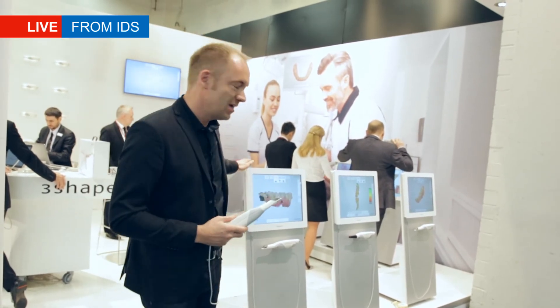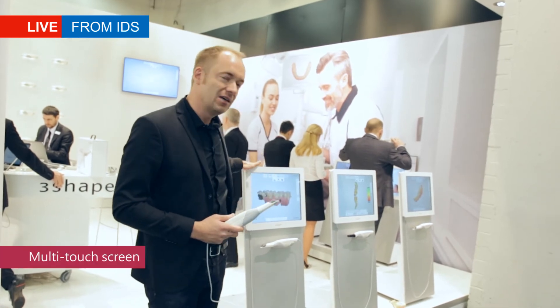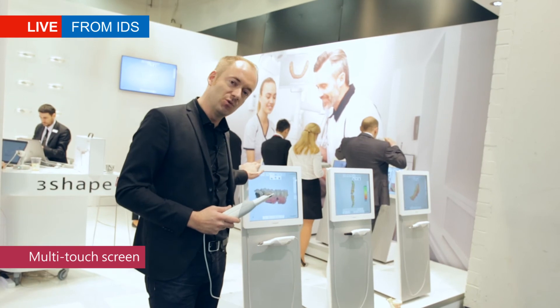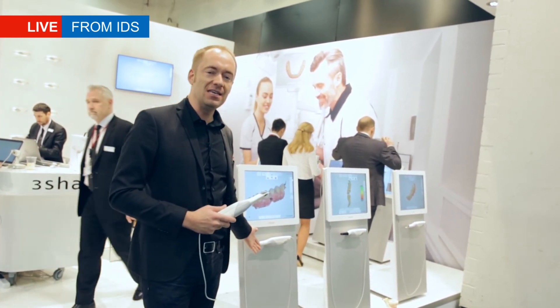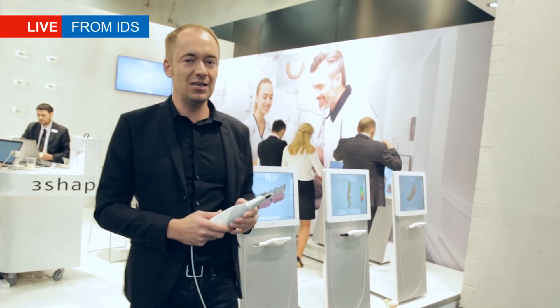It's operated through this system, and here we focused on only the most important things. We highlight in the design the beautiful touchscreen you use to operate it, and then you have the product — very easy to handle underneath, but also displayed almost like a sculpture in your dental clinic. Thank you.